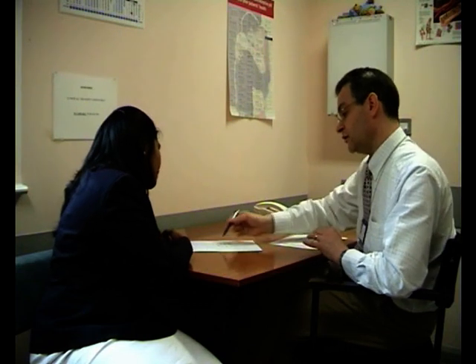Any other possible explanations where we have an abnormal pressure rise in the bladder? And is a capacity of 333 normal? It's a bit less. It's at the lower end of what would be normal, and she's got a high pressure for quite a low capacity there. So that could either be because the bladder's contracting, as you say, or what other explanations might there be?